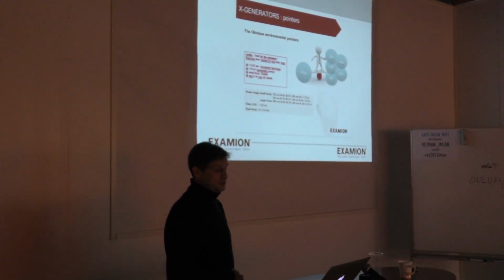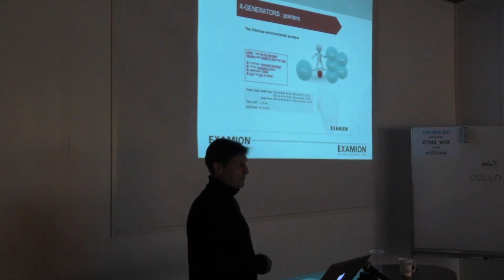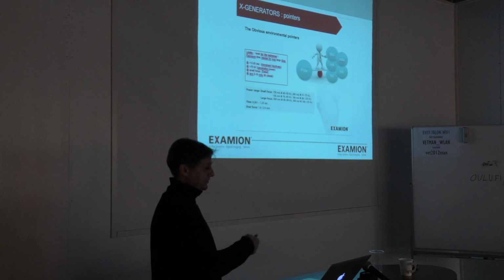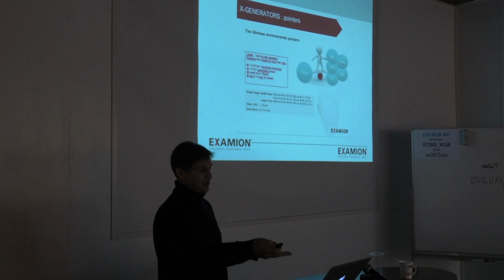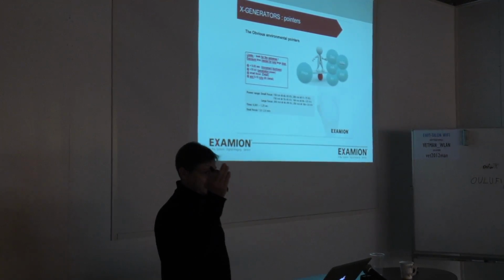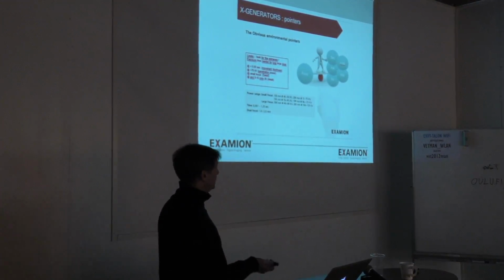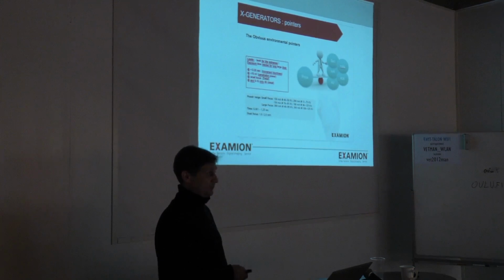The focal point of a machine, why do they have two? Well, normally you should be using only the lowest one. It's simply protection for the machine. The focal point is built on the anode of a machine, and the anode is where the electrons, electricity, fall into, produce a lot of heat, and where the X-rays come out eventually. But because of the heat factor, the more power you use, this is bad for the machine. It can actually destroy the machine if it becomes too hot.